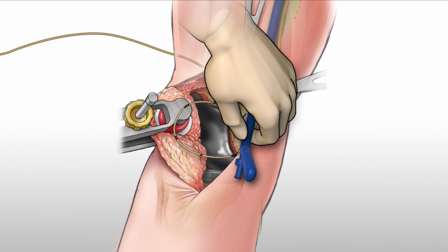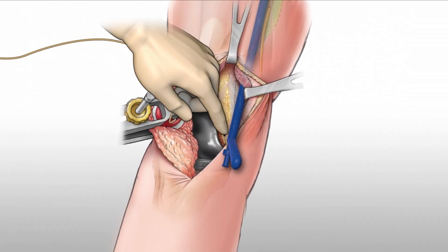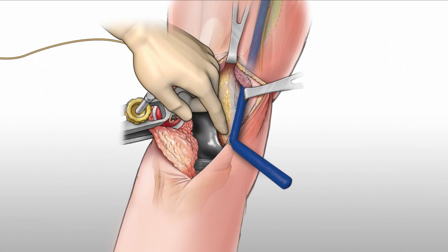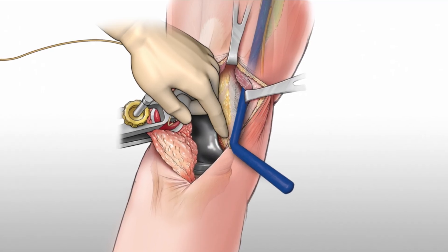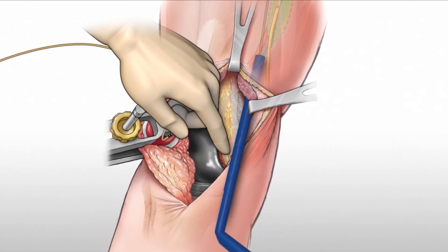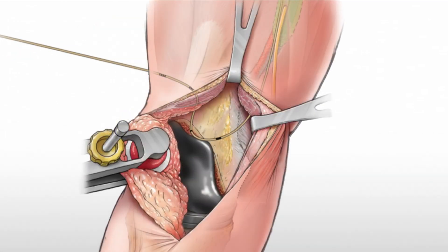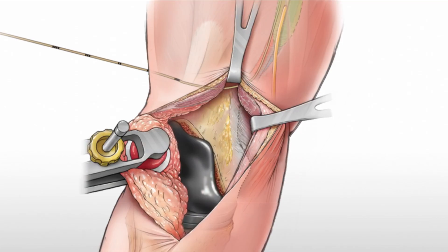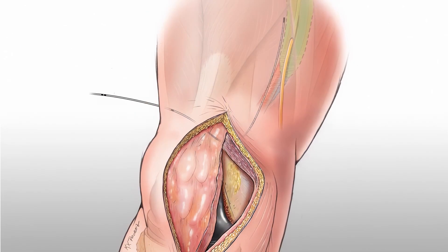Pinching the catheter against the femur, the trocar is removed. Rotating the handle medial while continuing to pinch the catheter against the femur, the slotted cannula is removed. The small loop of catheter is reduced by gently pulling the catheter snugly against the femur, leaving the catheter in place to provide a continuous adductor canal block.